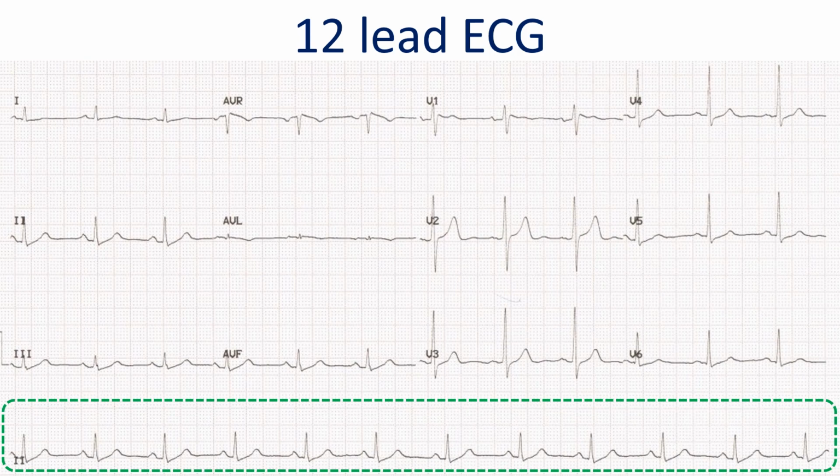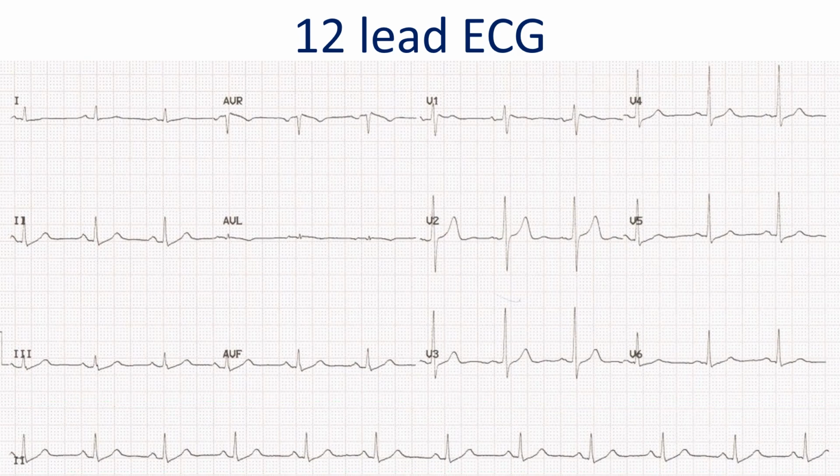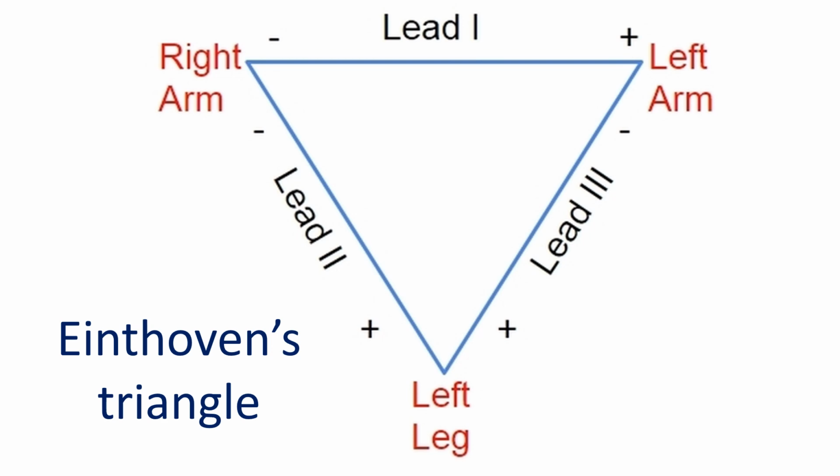But in most cases, a 12-lead ECG includes a long rhythm strip, either lead 2 or V1 or both, for facilitating rhythm analysis. If the ECG machine has only a single recording channel, 12 leads are recorded sequentially. More sophisticated recorders have the facility to record 3 or even 12 channels simultaneously. Simultaneous multi-channel recording can record all leads of a single beat and is better for analysis of complex heart rhythm abnormalities.